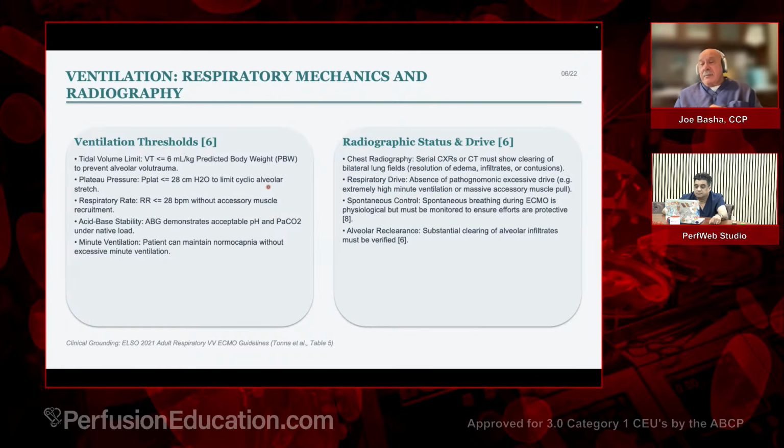Sometimes, if you're walking a patient on ECMO, I'll tell you what I've done, especially in the early phases when they're just starting to, I will see them starting to struggle breathing, and I will turn the sweep up, because that struggle is going to come from CO2, and I know that. And I can watch their breathing improve dramatically. And this is very important. I'm not trying to cheat them out of being able to breathe on their own, but I need them to be able to condition so that they're not so deconditioned they can never be decannulated. So it's a balance between the two.